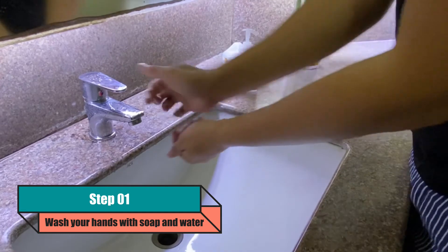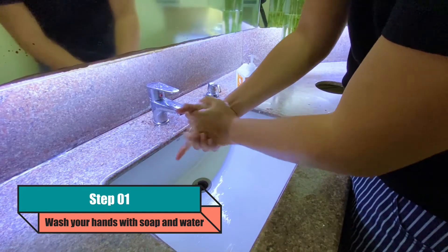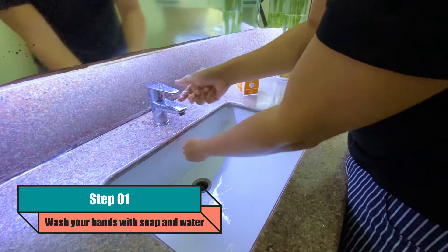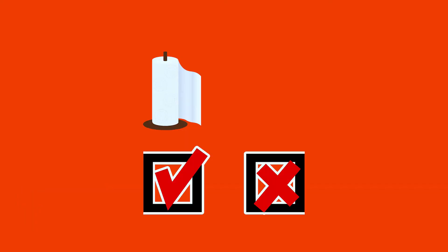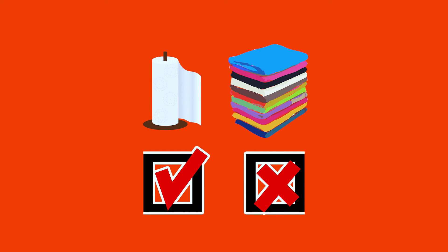The first step is to wash your hands thoroughly with soap and water. Dry your hands with a paper towel or air dry them. Avoid drying your hands with cloth or rags, as these may contain bacteria and lint — those are things you want to avoid.